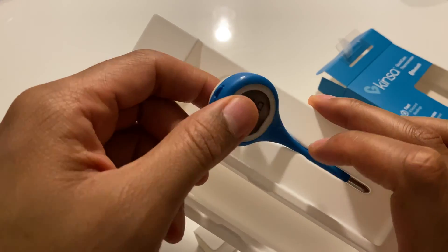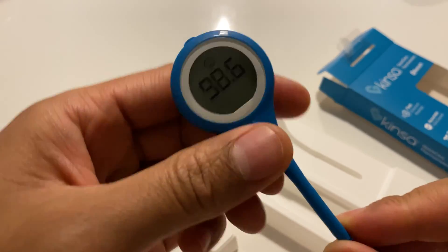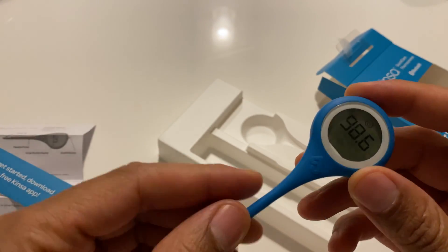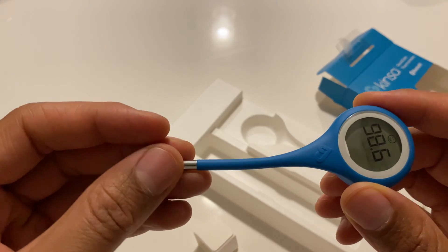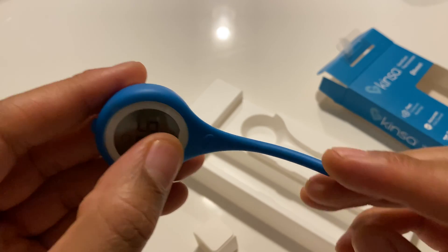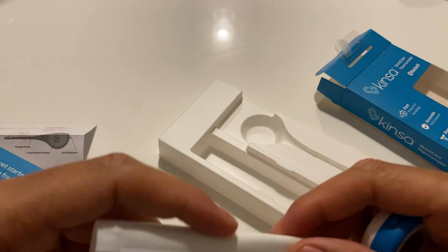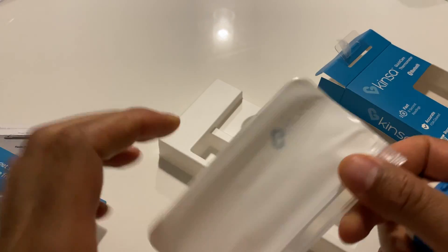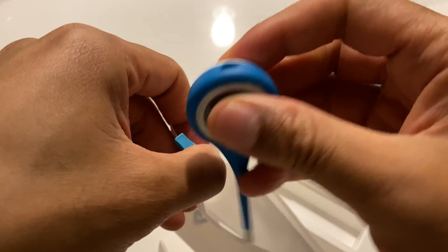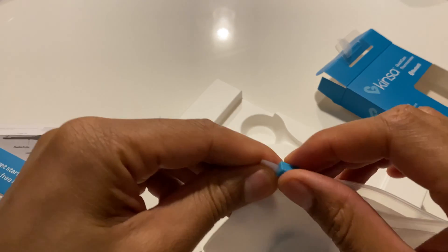I guess this is like a sleeve that the thermometer slides into. I'm going to pull the thermometer out. The thermometer is very flexible. Like I read, you can use it on several different areas: the mouth, armpit, or rectum. I'm guessing that's why they made it flexible. And there's a little sliding pouch — I'm guessing once you clean it and you're done with it, you can put it back in there.